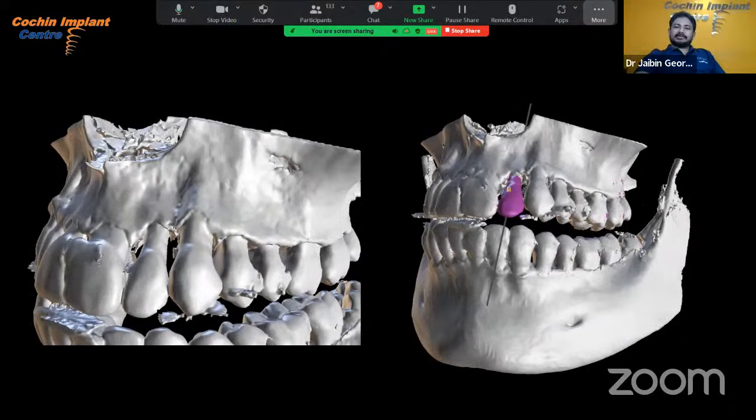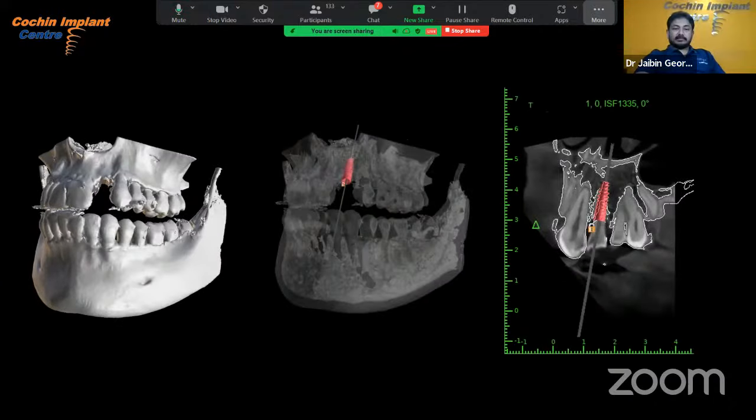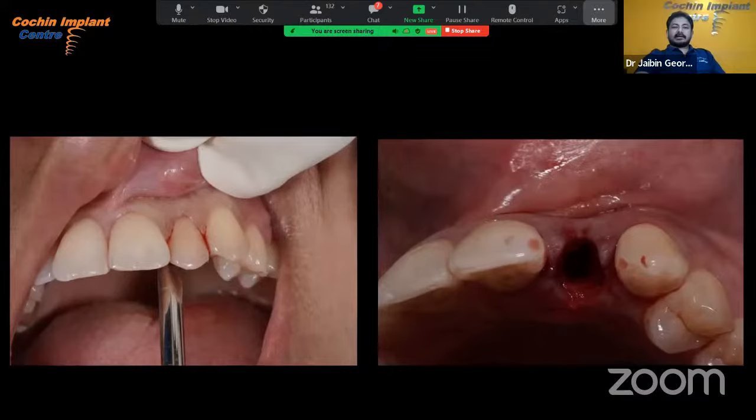In every case we do a virtual planning. In this case, we took the CBCT image. This is the 3D rendered image. And we did a virtual extraction of the fractured tooth. The implant was positioned. A virtual planning was done. And then we started with the real surgery.